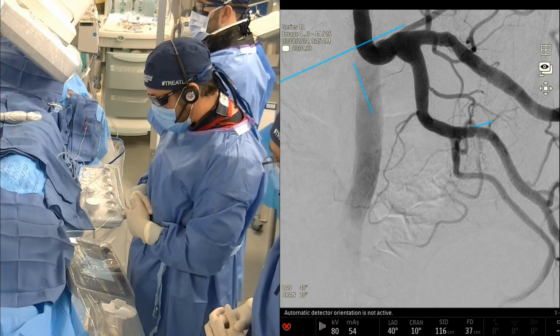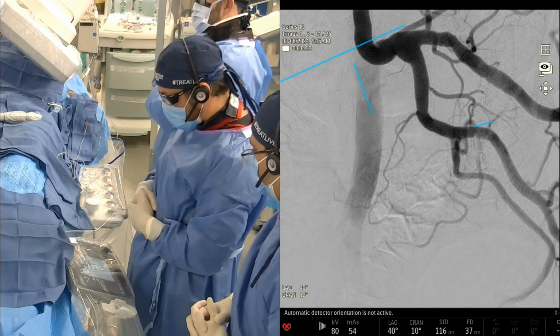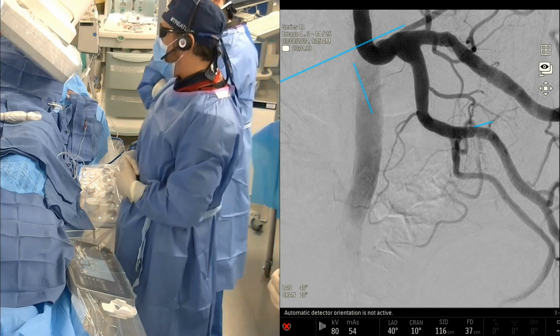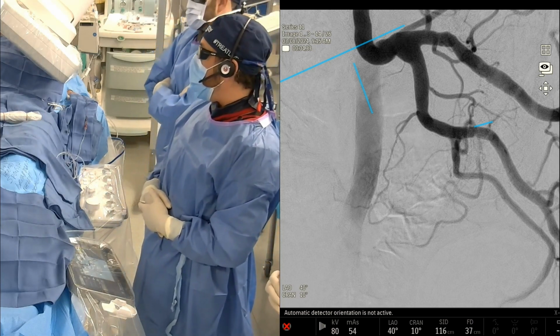So, before we cannulate these, what I like to think about is which microcatheter would give us the best chance of cannulating this, which wire. And then obviously, if we're using n-BCA, I like to try to use balloon occlusion whenever possible. It gives us a much deeper penetration, which we can talk about in a few minutes.